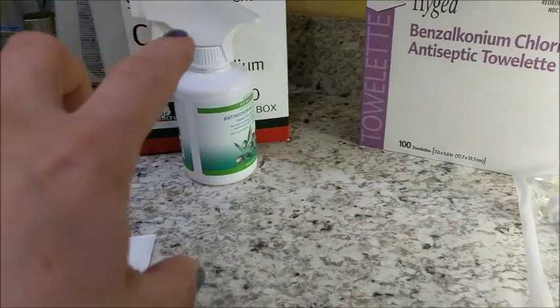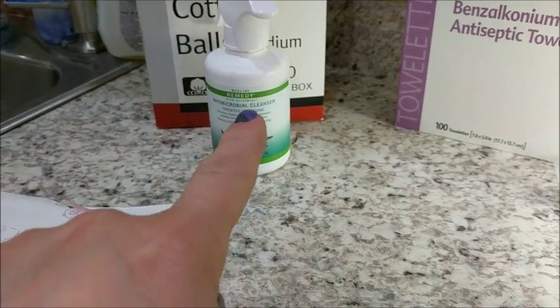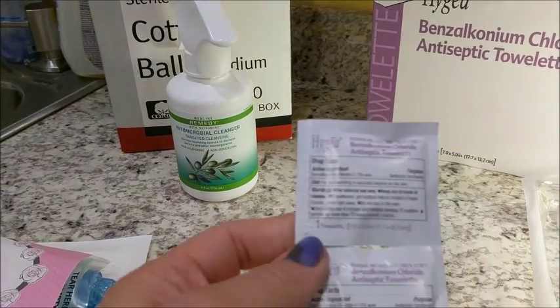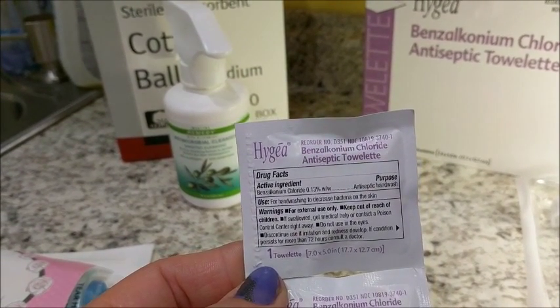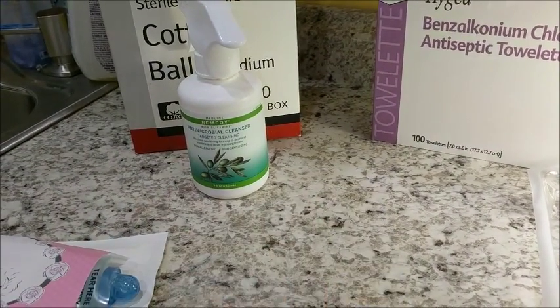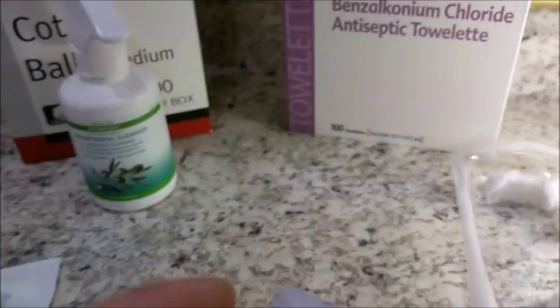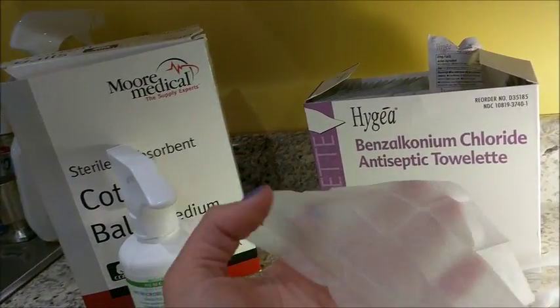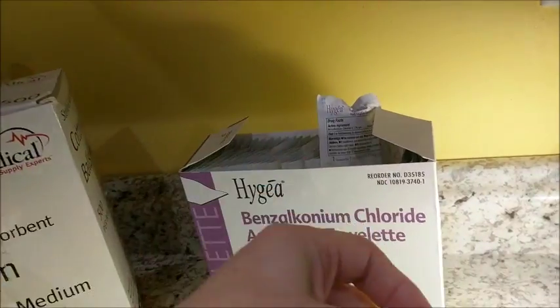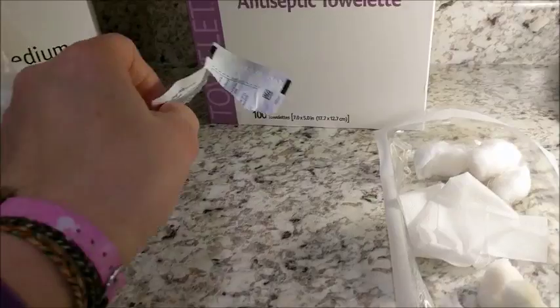There is another option if you don't want to do the cotton balls and the antiseptic squirt bottle. They have these towelettes that would be easier, especially if you're on the go. These are nice and big — they kind of remind me of the towel you get when you're washing your hands after eating ribs. These are a pretty good size, so especially if you're out and about and you don't want to carry a spray bottle that might leak or worry about getting water, you can use these. These do not have to be washed off.